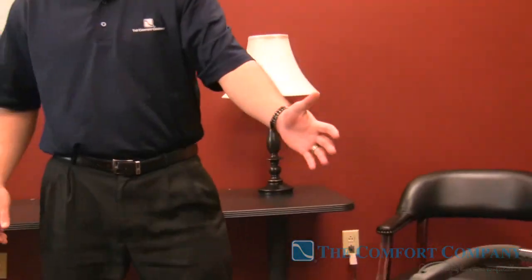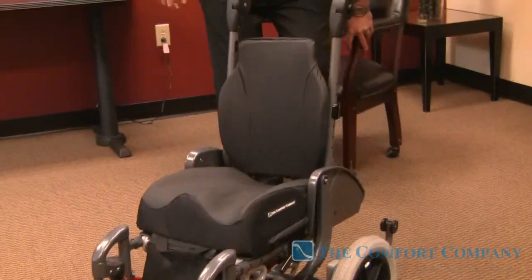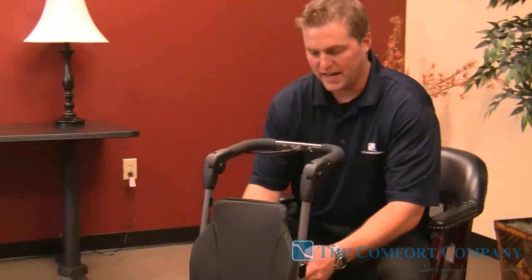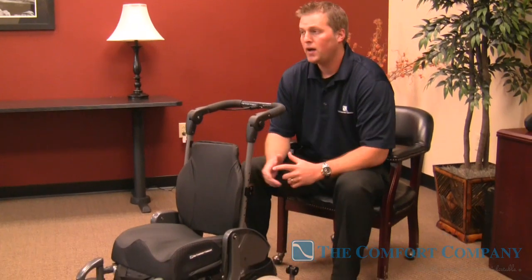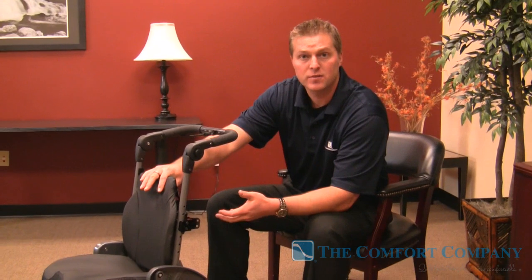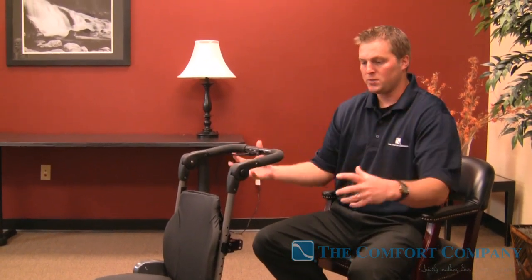The Embrace system — here we're going to go over the pediatric version. The things I'd like to go over with you are a technique for mounting the system where you're going to hit a home run every single time, the adjustments you can get with it, the moldability of the back, the dynamic nature of the back, and some of the growth features. It's basically an all-inclusive system.